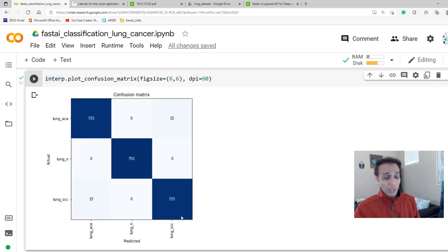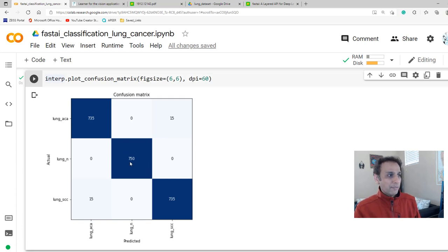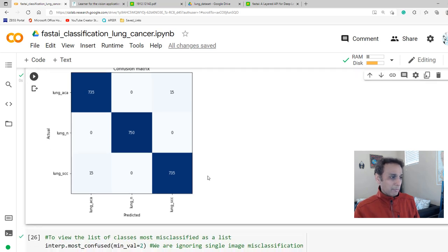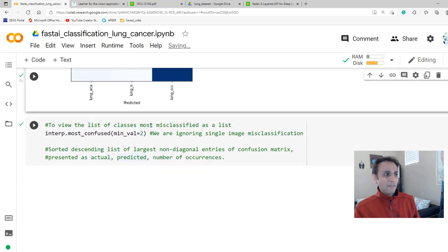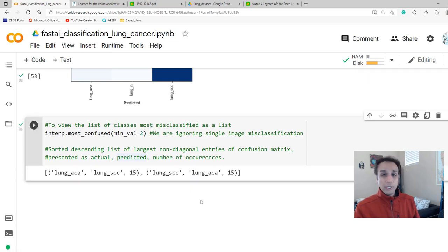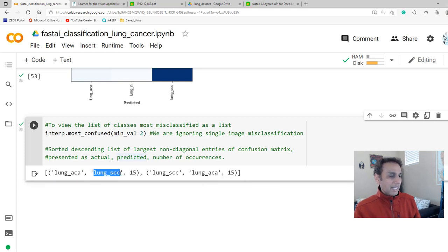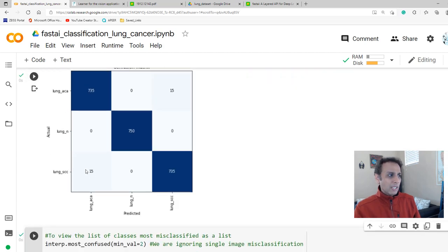The confusion matrix now looks excellent. All 750 benign images are correctly classified as benign. Only 15 images each are incorrectly classified between ACA and SCC — lung_ACA mistakenly predicted as SCC 15 times and lung_SCC mistakenly predicted as ACA 15 times. This is a very well-balanced confusion matrix. You can also use interp.most_confused() to list the most misclassified class pairs, which is especially useful when you have more than 3 classes.